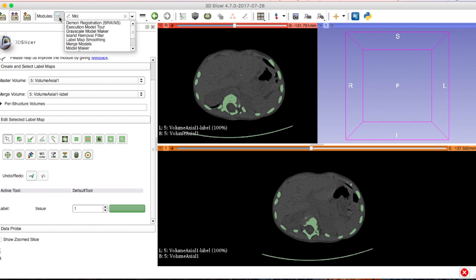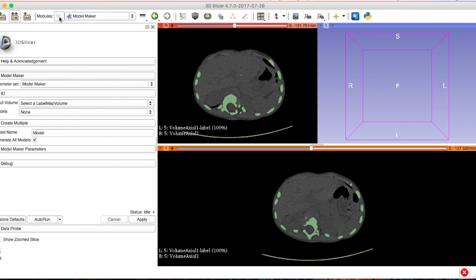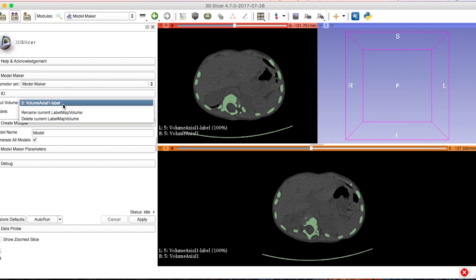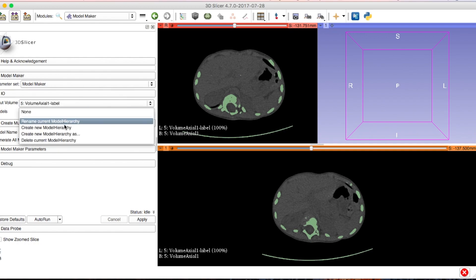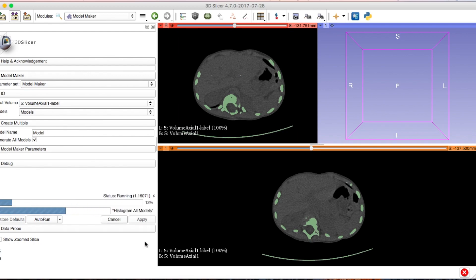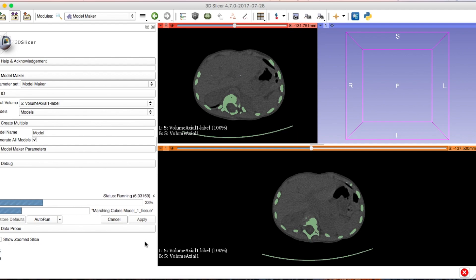Scroll down to where it says 'Input Volume', select that, and the scan number and volume — such as 'Axial One Label' or whatever plane you're working in — will pop up. Click that, then scroll down to 'Models', click 'Create New Model Hierarchy', and click Apply. This does take a minute the very first time.